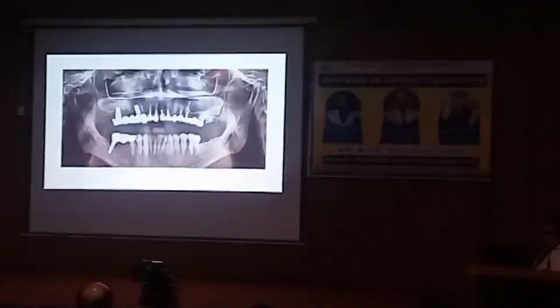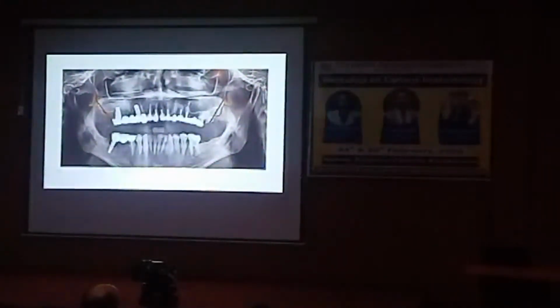Let's mark your pterygoids. And the higher they are, the steeper your vertical angle. So if we compare the three X-rays, that's what I want to show you: you need to plan your case on your own, and every vertical angle is planned with this least effort. Horizontal angle. Are we all clear with the vertical angle?